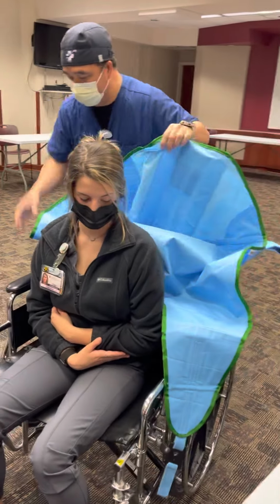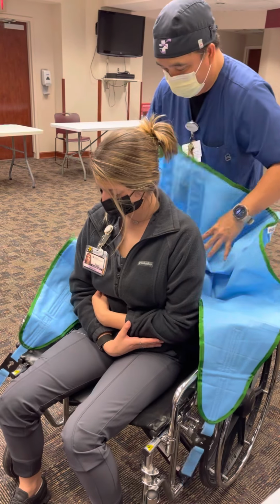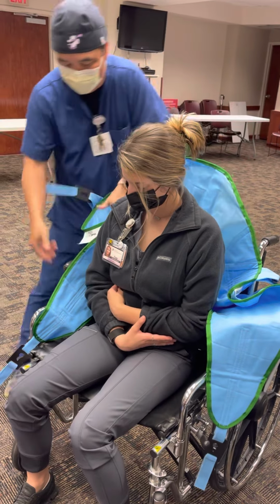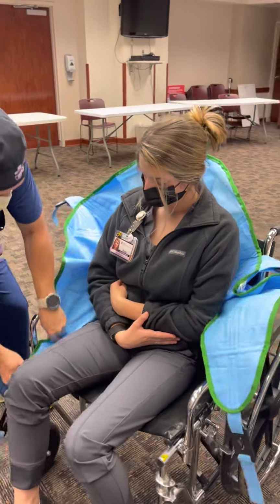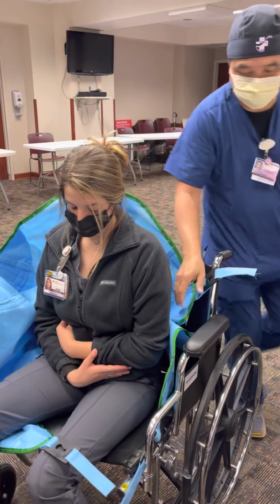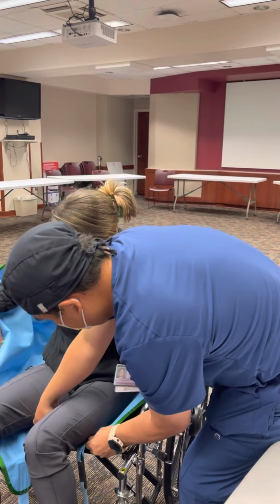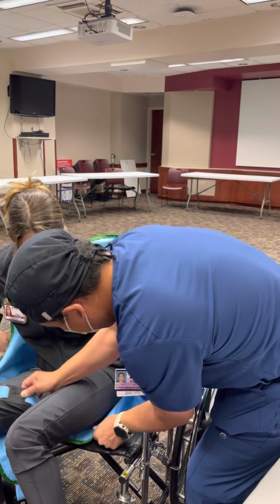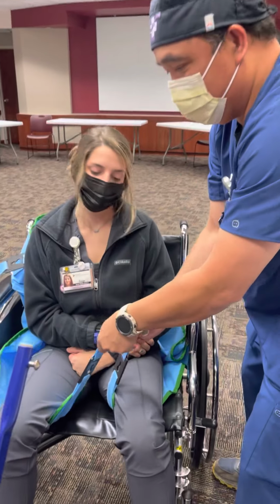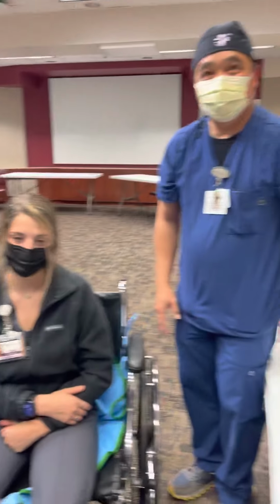Just slide it down here as far down as you can, like where it was when you transferred the patient here. And ask the patient to kind of lift the legs up, so we can get right there. Can you lean that side a little bit, please? There we go. So the key is these straps cradle the thighs when you raise up, so they won't slide off the sling. So that's pretty much it. All right.